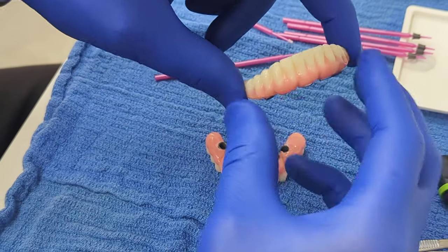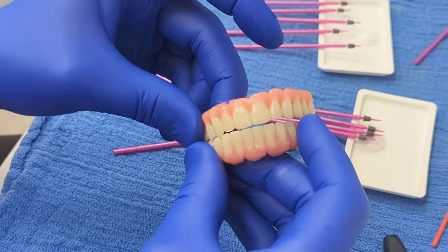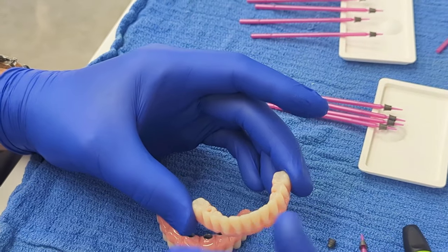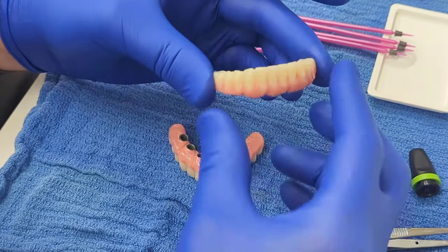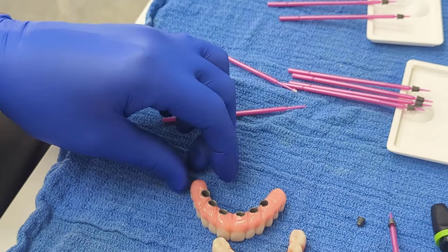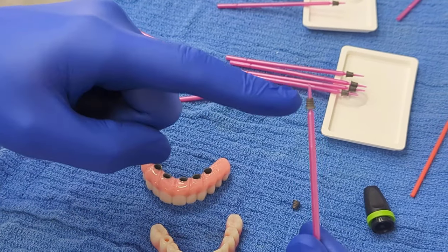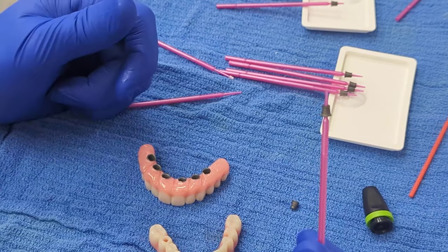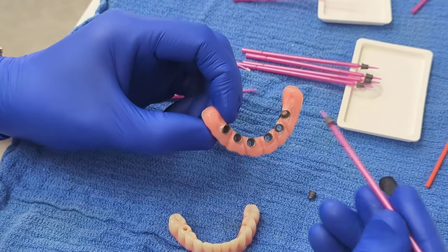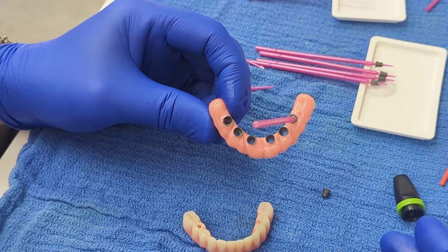And so when you go ahead and you come back to the wearability of these teeth and the stress and strain on the teeth, and if you consider that to be a cycling effect over years, what you'll find is that in zirconia, these titanium abutments or shoes will oftentimes debond within a zirconia restoration at a much higher rate than they would ever debond on a metal-to-metal sandblasted surface that has been properly cemented.